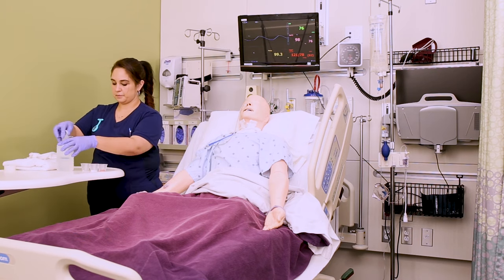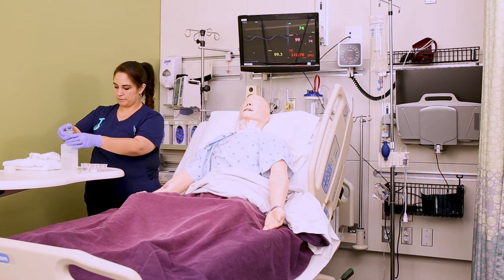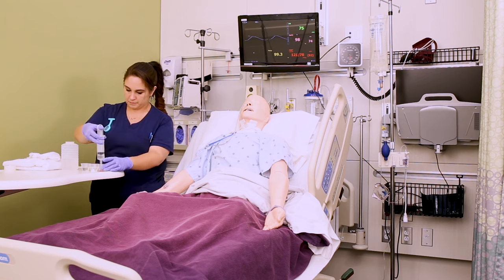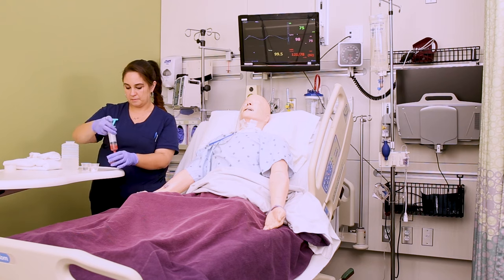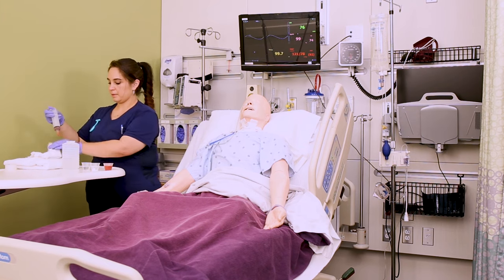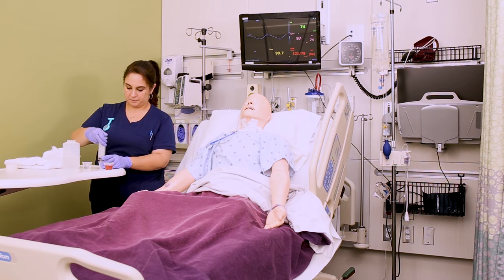Let's say we have three medications to give — they've all already been crushed. You're going to mix each one of them in their own medicine cup with about 20 or so mils of water. Tap water is fine with an NG tube. You also want to have plenty of water available to flush before and after each med. Mix each medication really well in their cup so that it gets fully dissolved — you don't want any clumps or chunks of pills. If you need to crush them better before mixing, do that. If you're having trouble getting them to dissolve, sometimes using warmer water helps.